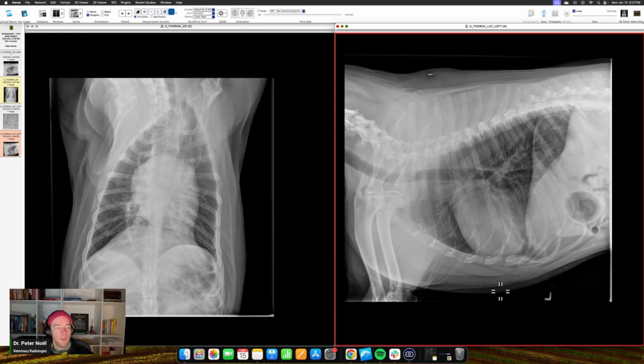And then you just let the person that requested the service decide, do they think it's aspiration or infectious? Because there's a lot of times we don't get that information. So just because of its right middle location and the ventral distribution, it can still be an infectious etiology. I think there was a report, I'm sure there were four dogs or six dogs in it, but canine influenza still had a ventral distribution in some cases.